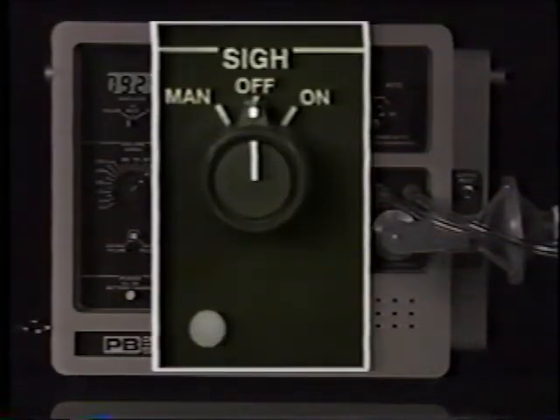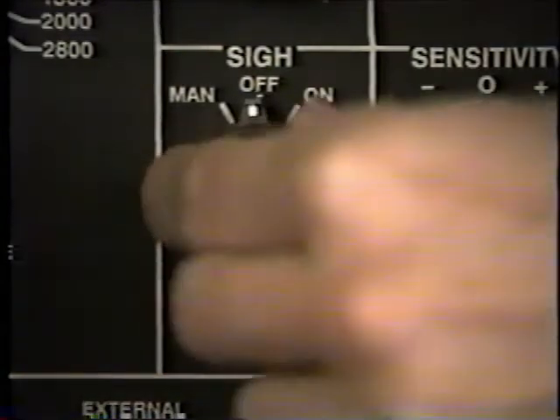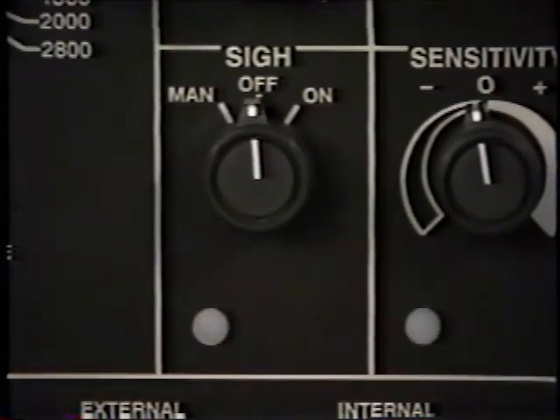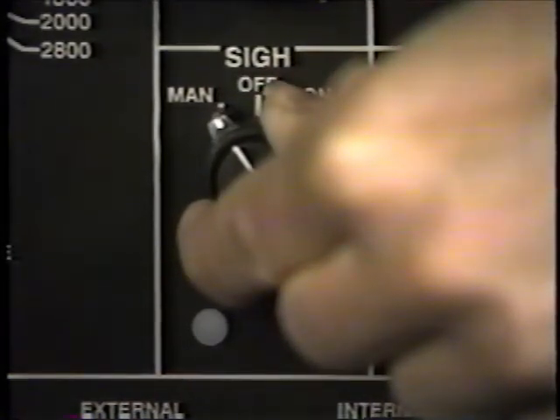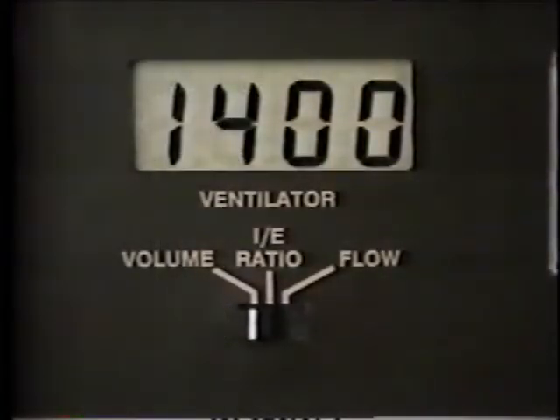The sigh control is a 3-position rotary switch. In the on position, the Companion 2801 delivers 3 consecutive sigh breaths every 10 minutes. The manual setting is spring-loaded and returns to the off position. When held, consecutive sigh breaths will be delivered until released. The indicator light remains on until all sigh breaths have been delivered. Use the sigh switch in the manual position to verify the sigh volume setting.